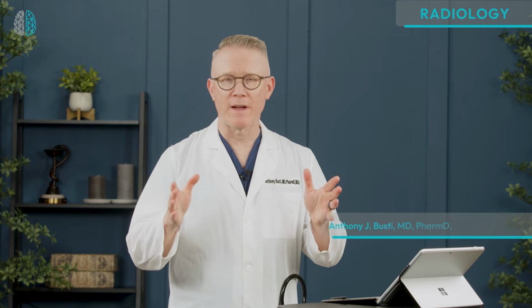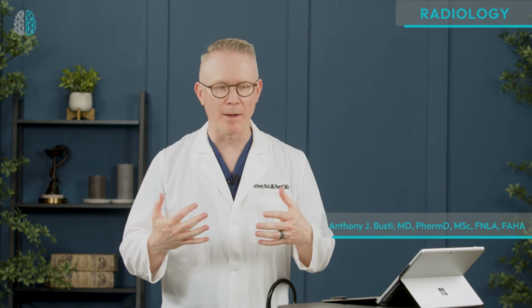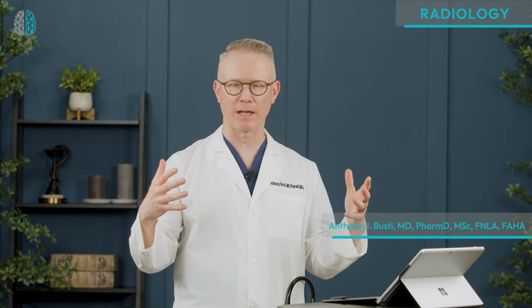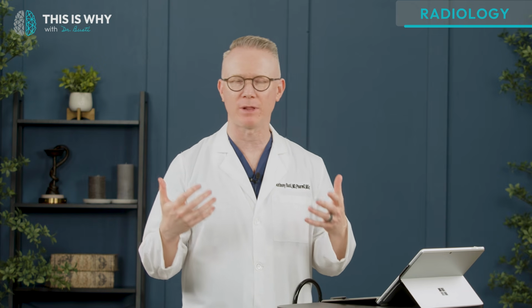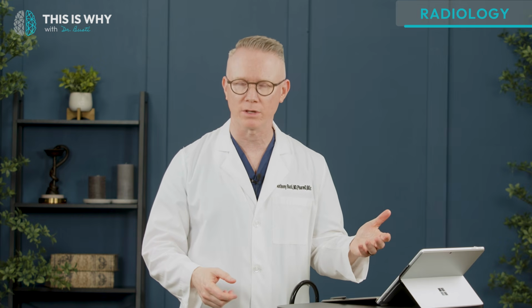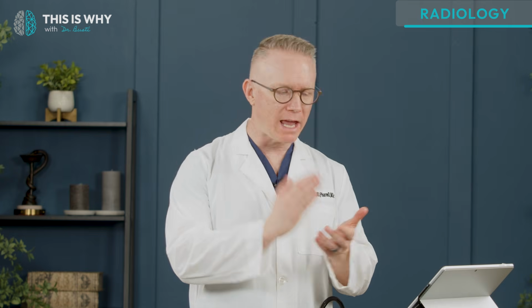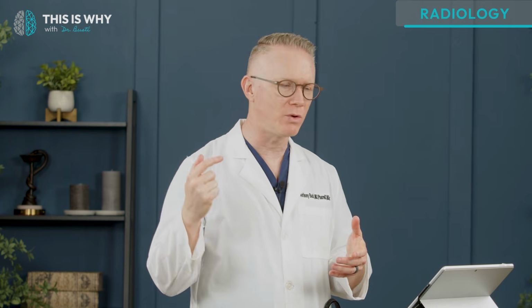So I hope you found that to be helpful. I always find that integrating the abnormal into the normal really gives me that big picture of why am I learning this? Why do I need to acquire the skill set of properly assessing a chest radiograph, and the value of knowing what normal looks like? So you can't discern the abnormal if you don't know the normal, and it just requires repetition.